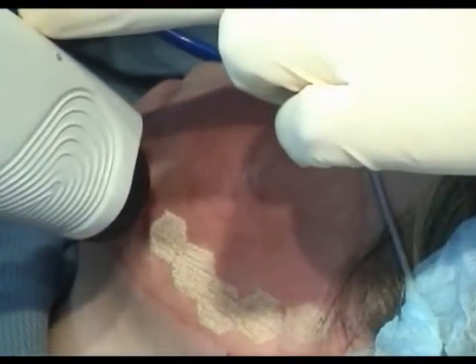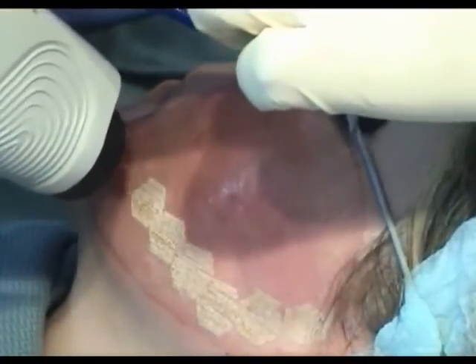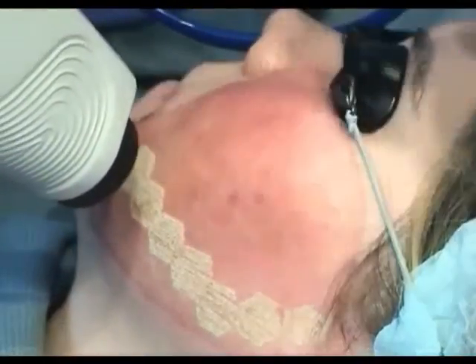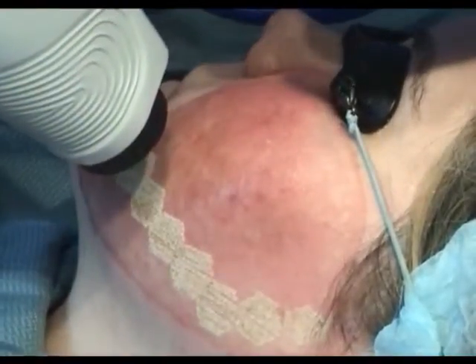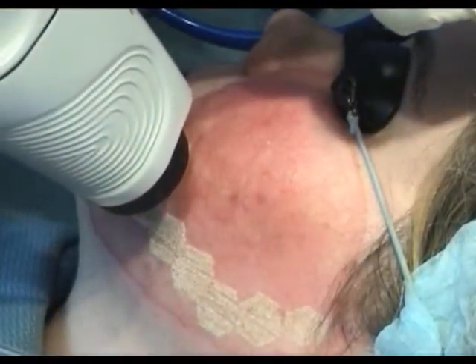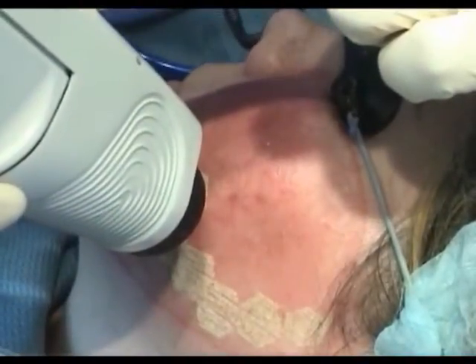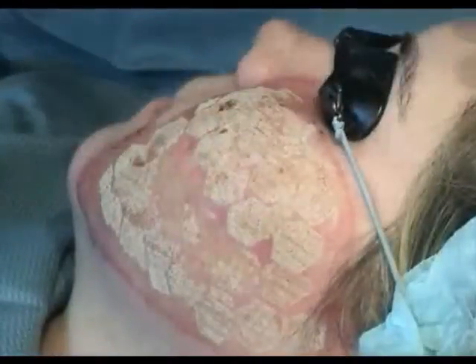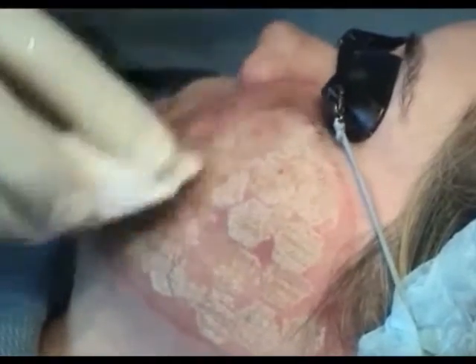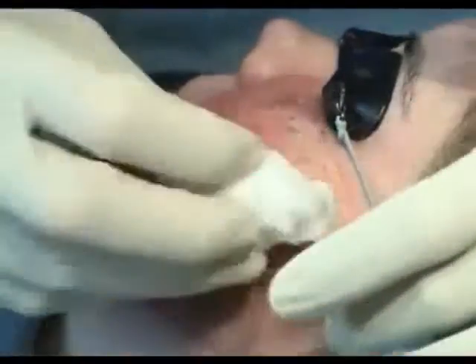Instead of performing the first pass with an erbium YAG laser followed by this pass with the carbon dioxide laser, many physicians prefer simply performing 2 passes with the carbon dioxide laser. Note the slight tissue contraction that occurs with each pulse with the ultrapulse laser. Following this, the entire area is thoroughly wiped down with wet gauze. It is very important to remove all of the debris created by the pass with the carbon dioxide laser.